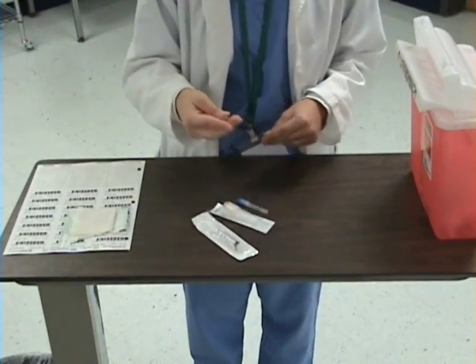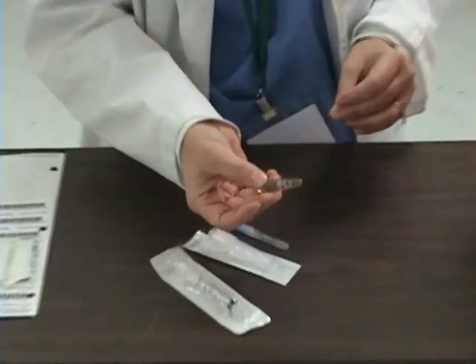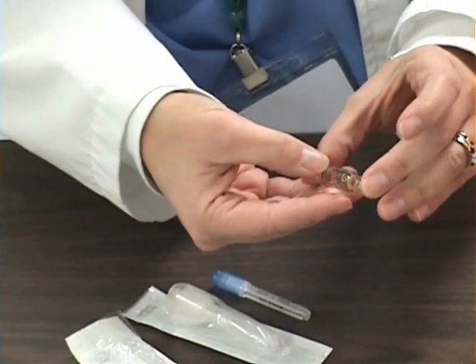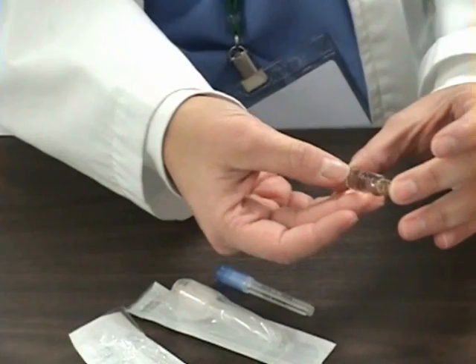I will begin by taking my ampoule and checking the medication against the order that the patient is to receive. I also want to check the expiration date on the ampoule to make sure that it is good.